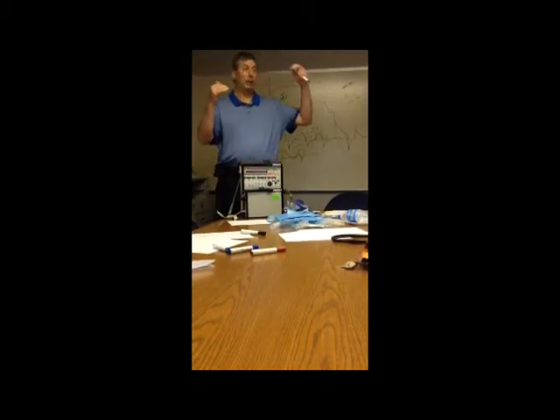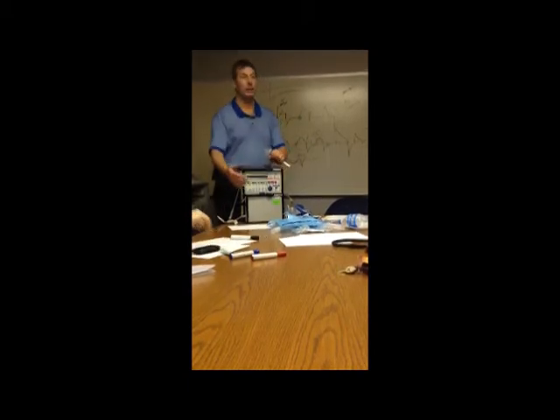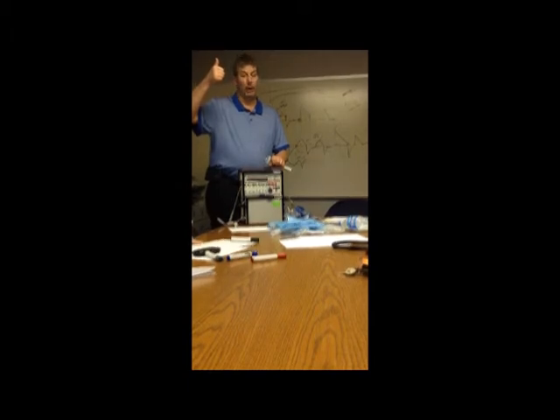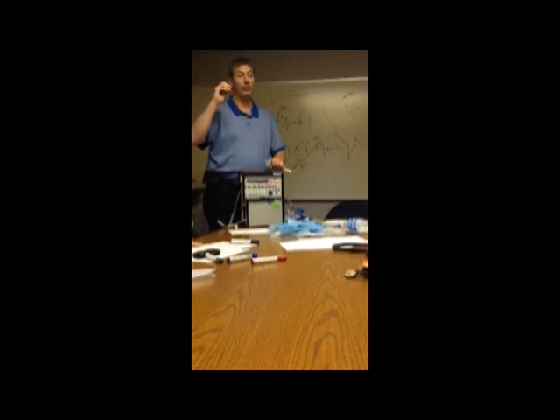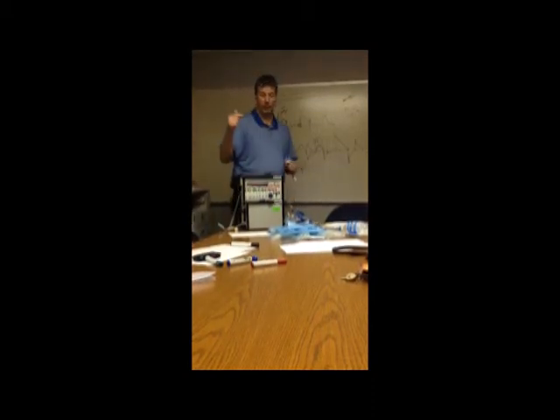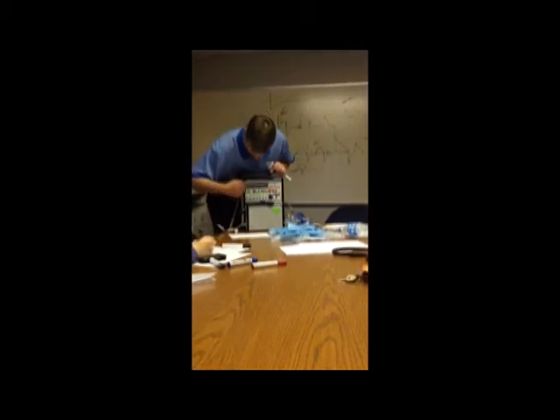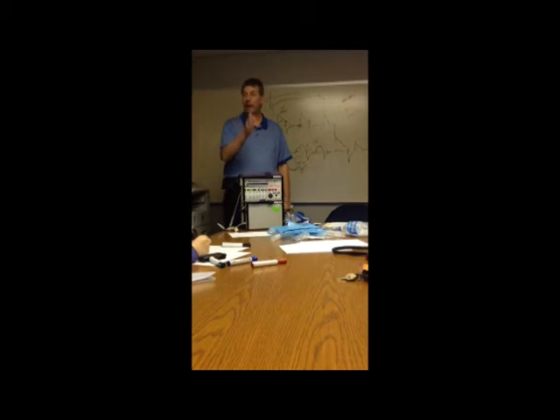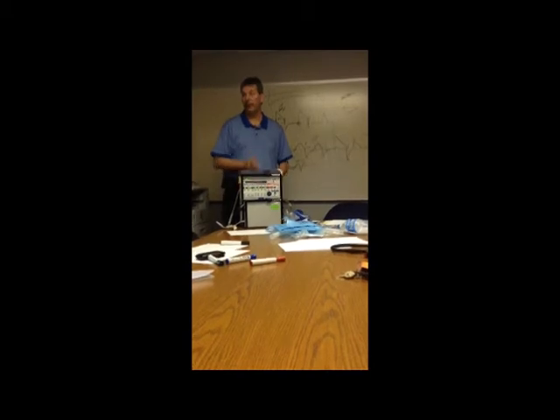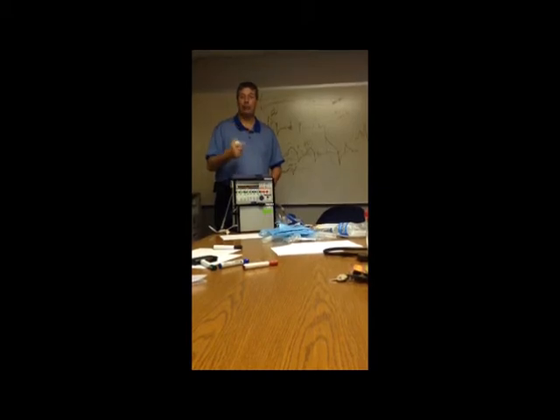So, in that case, what you want to do, since you don't have the ability in volume to change their flow, shorten their I time. That increases the flow. The faster you blow it in, the less time it takes. So if you give it less time to get that volume in, you know you're increasing the flow, right? Like I said earlier, if you're blowing it in at 500 in 1 second and you're now doing 500 in half a second, it's blowing twice as hard. So if that pressure manometer goes negative at any point during the breath, any point, or it goes up, comes down, then goes back up before it ends the breath, you need to start shortening the I time. That'll increase the flow, they'll get their air faster, and they'll feel like you're their best friend.